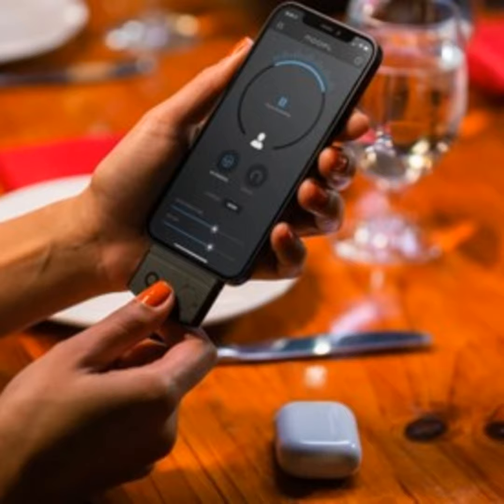And other than those three particular headphones, we haven't found any where that Bluetooth latency is low enough to make Noopl useful. Hopefully that changes in the future, but right now it's those three headphones or made for iPhone compatible hearing aids.